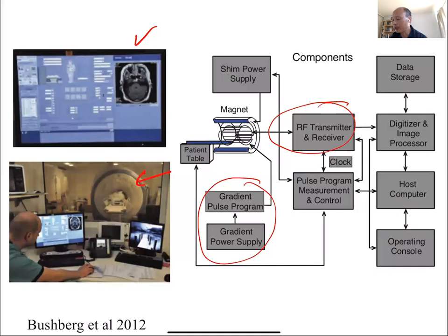And you'll notice here, and this is what really makes MRI very unique, is that there's an ability to pulse program. So you actually have a lot of control over how these fields are changing. And the manufacturers are quite open about allowing you to get in and create any program you want. And so that's made MRI a very rich area for academic research.